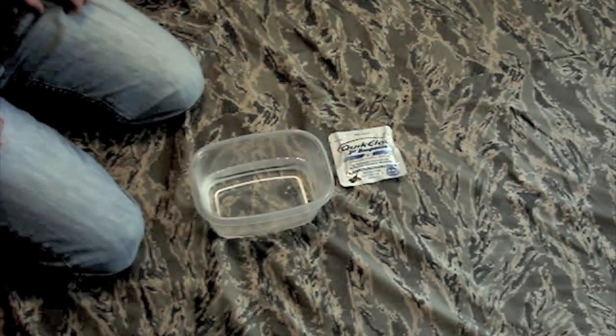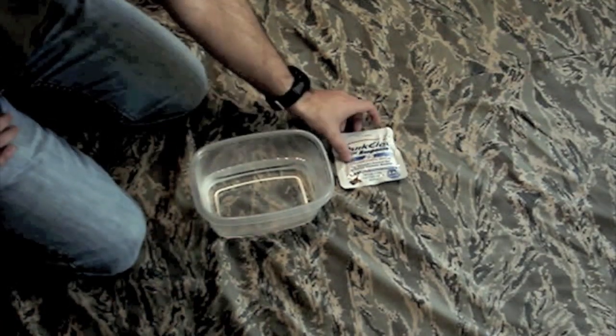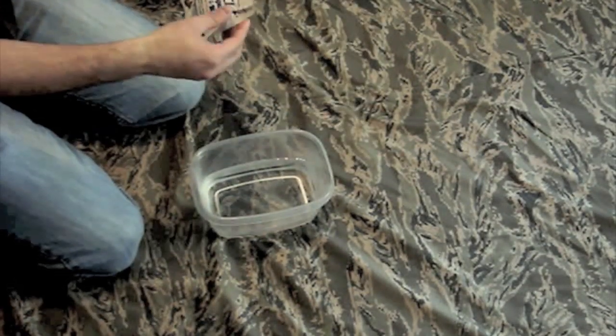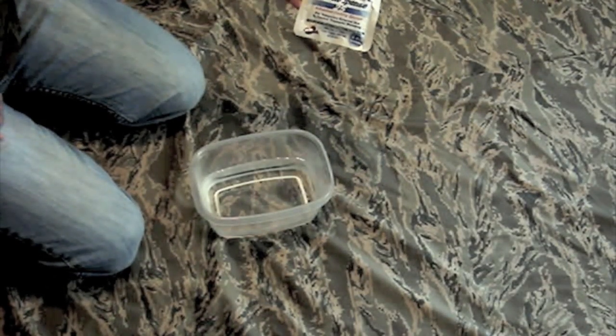QuickClot actually took notice of this and decided they wanted to reformulate, which they did. So now you have a new mixture. This is QuickClot First Response — it's the 25 gram bag.